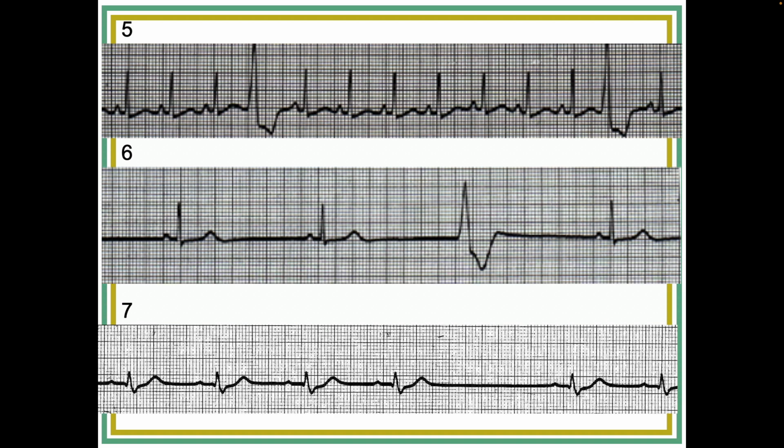So what's happening is the ventricles are waiting, and they become irritable, but the sinus rhythm is so slow that it just throws out a beat. To be honest, it's just coincidental that it comes in right where the other sinus beat should be. In fact, the other sinus beat probably happens, you just can't see it because on the ECG strip it's engulfed, if you will, by the ventricle.